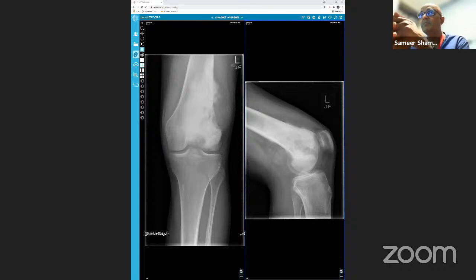So you said diffuse abnormality involving the distal left femur affecting the metadiaphysis, with bone destruction, endosteal destruction on the lateral margin and extension outside, resulting in periosteal reaction as well as soft tissue extension. This is likely to represent an aggressive bone tumor, likely osteosarcoma, considering the matrix looks like osteoid in nature. You can also mention that because of this high bone-like density within the joint, there is likely intra-articular extension.